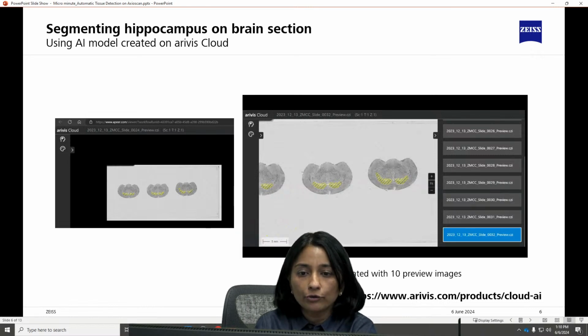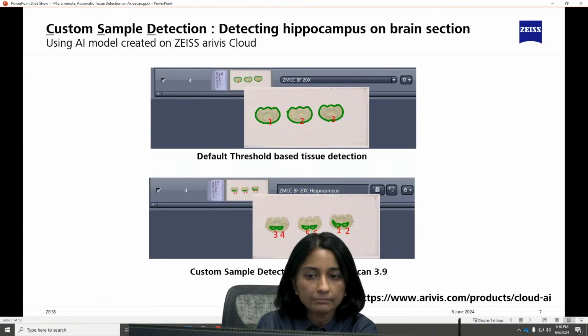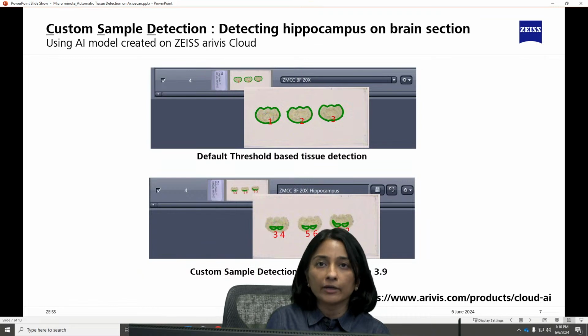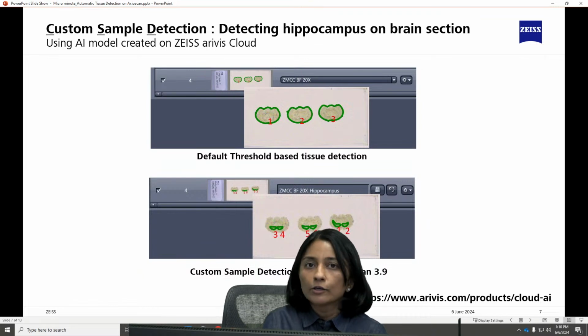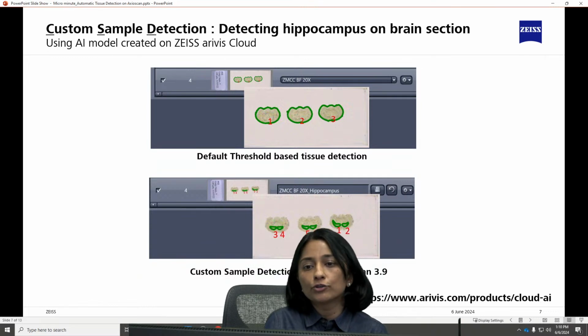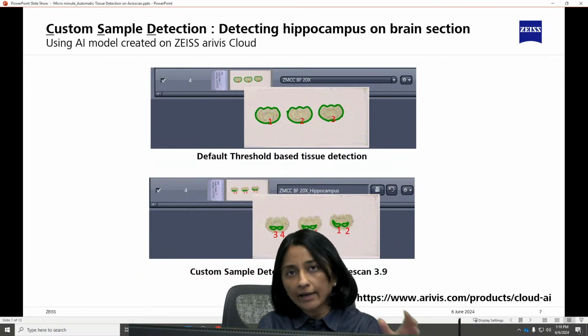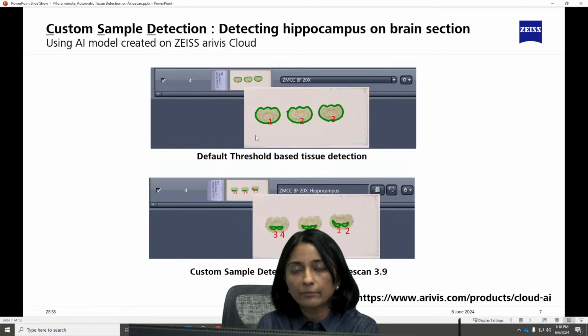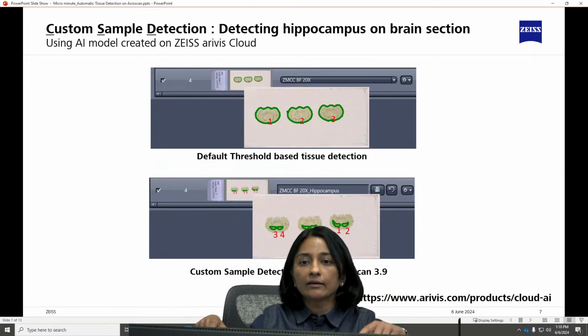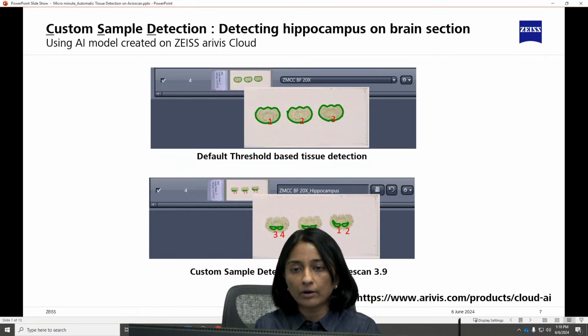And what I'll show you next is a preview of the outcome before we go at the system. So basically, imagine just detecting subregions of your tissue, right? What typically is done so far is you are detecting the entire tissue. Like we saw in the very beginning of this presentation, you can delineate your entire tissue section with that green border.